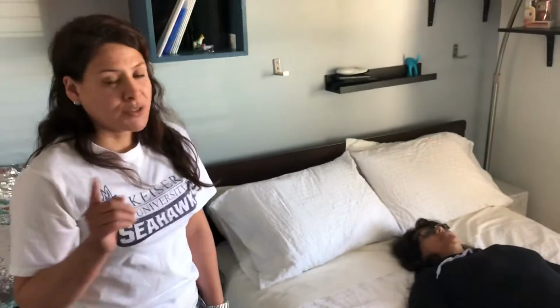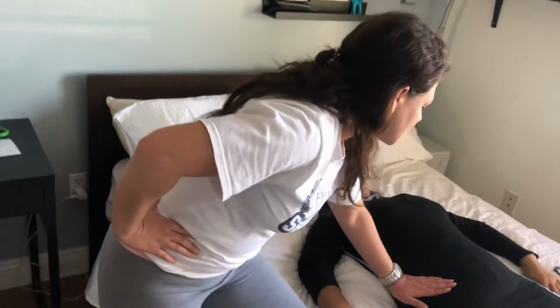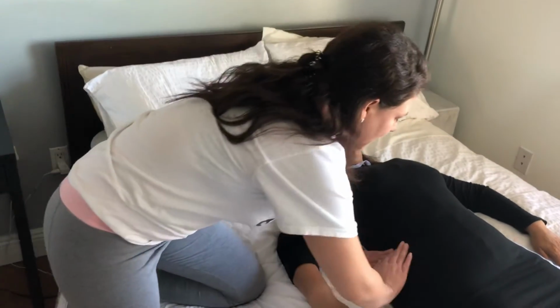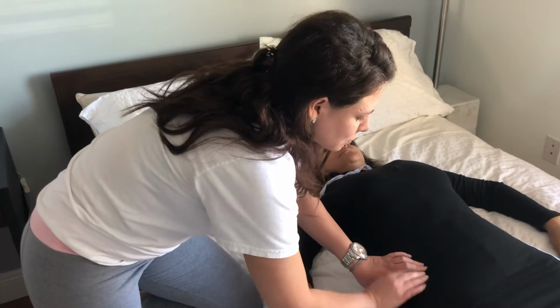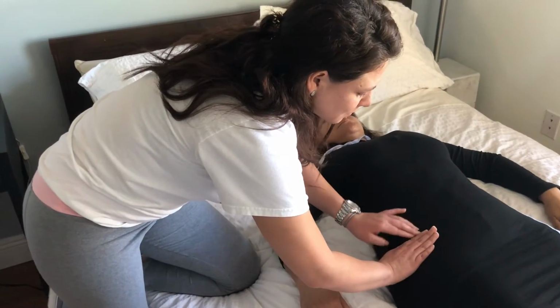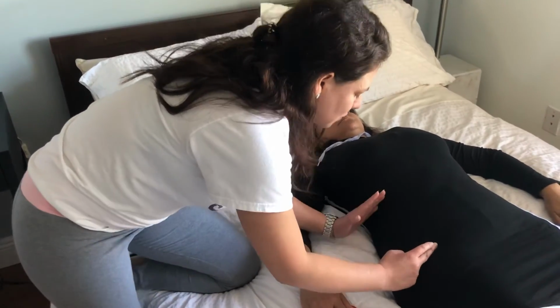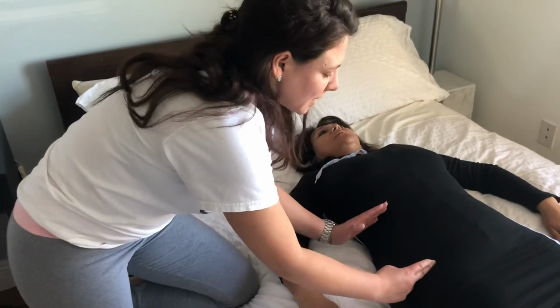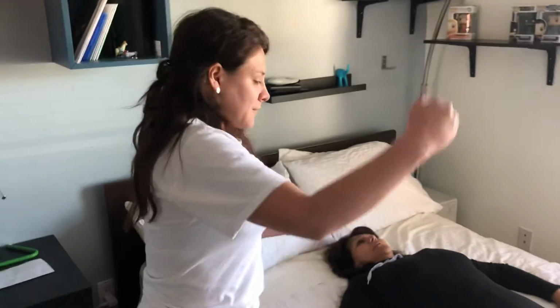If we're gonna see the rectosigmoid, we're gonna angle the tube 30 to 40 degrees cephalad. The central ray is gonna be at the level of the ASIS. I have here my iliac crest, and I can feel her ASIS right over here. So we're gonna go 2 inches below the ASIS. 2 inches will be like 4 fingers. So I will put the central ray over here. And then I will use an 11 by 14 cassette lengthwise like this. That is to see the rectosigmoid colon. That is cephalad. If we're gonna do the PA projection, it's gonna be the same.